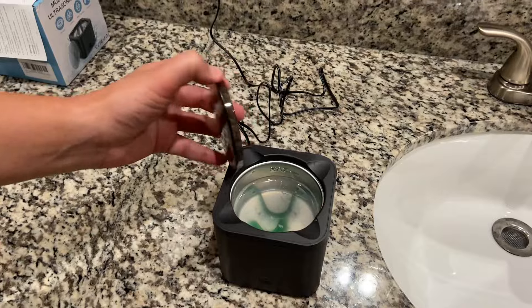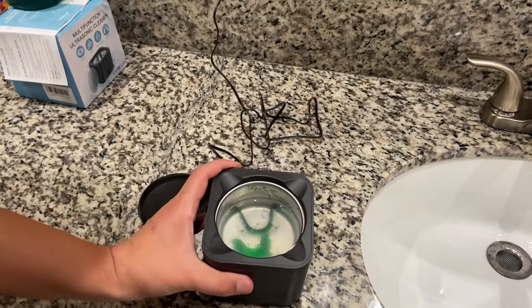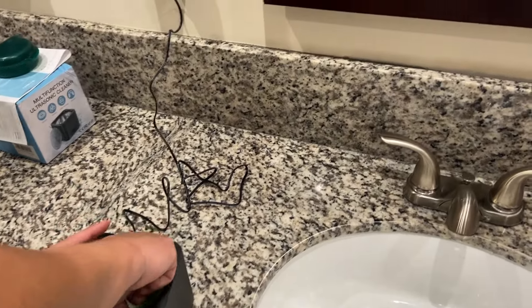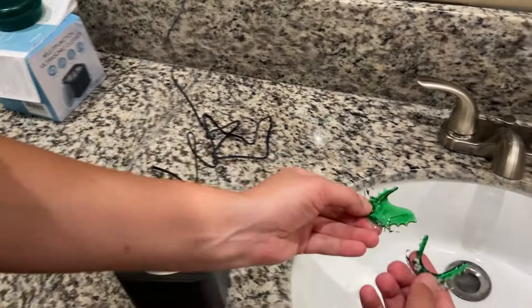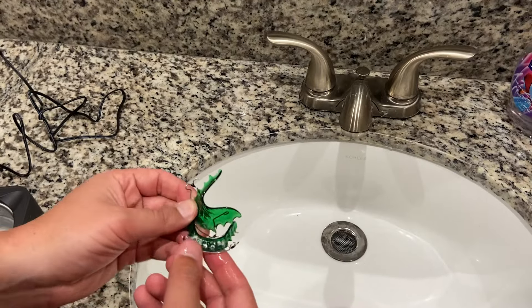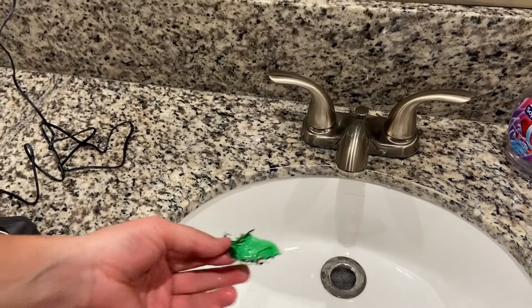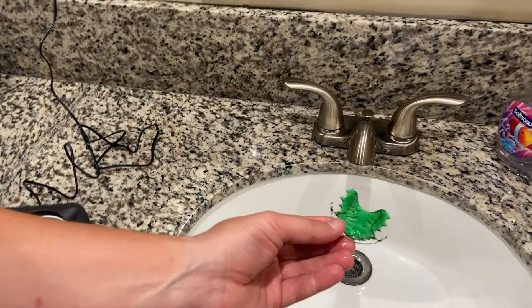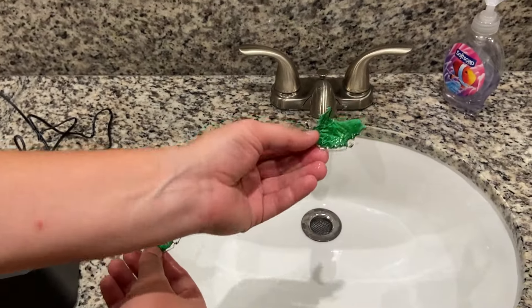All right guys, so it's done. You can see all the stuff that came off of it floating at the top — kind of gross, but it actually worked. It got a lot cleaner. I'm going to go ahead and scrub this off with a toothbrush, but you can see a lot of that hard calcified stuff came off the retainer. Now it's pretty clean, so check it out.